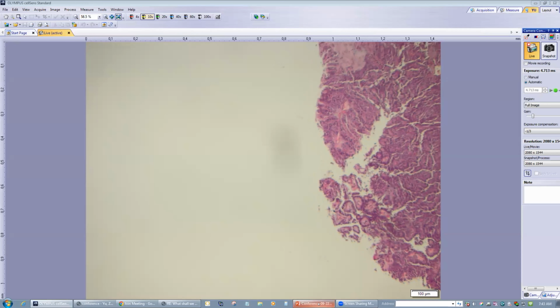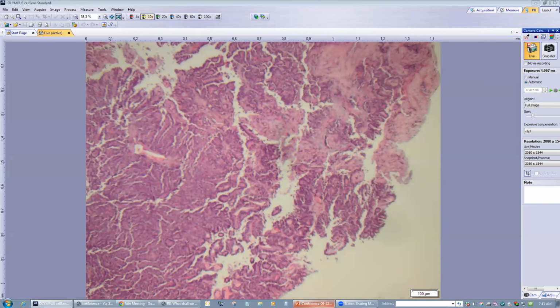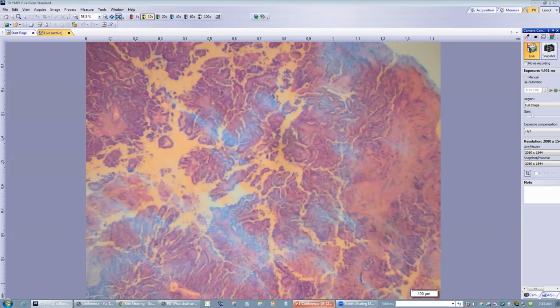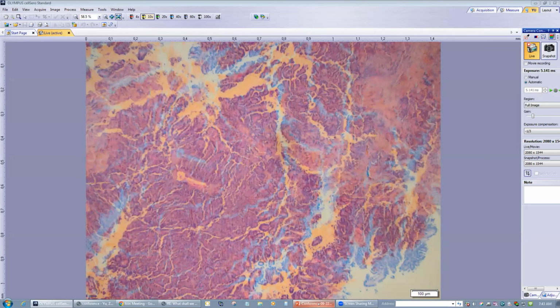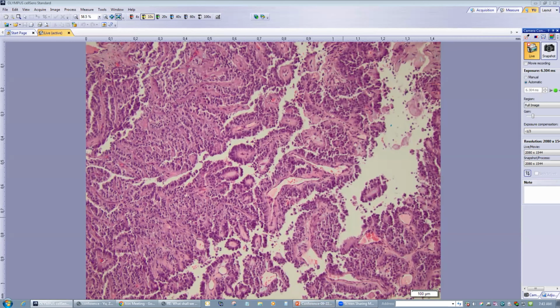So this is the biopsy specimen. The lymph node is already gone, that's a deeper section, but this is the biopsy, the majority being tumor. At low power, you can see it looks papillary and pink. Again, it looks like an almost papillary structure.